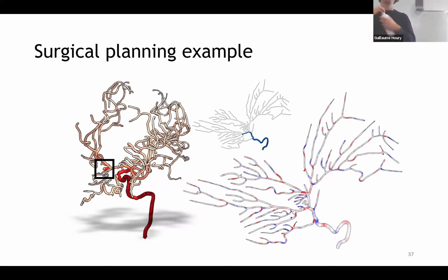Because basically when you see it, you may think, okay, it's fancy, but who cares? But the thing is that when you start talking to people who do surgery, who do interventions, etc., they always talk about the gut feeling and the experience, right? So basically what they call gut feeling is the difference between what you can teach to students and what you do after a decade of practice. And basically for this specific problem, the experience and the gut feeling is important when they see the 3D volume and they decide, okay, what are the catheters that I'm going to choose to reach this location?